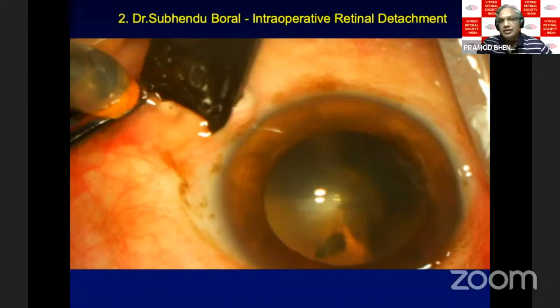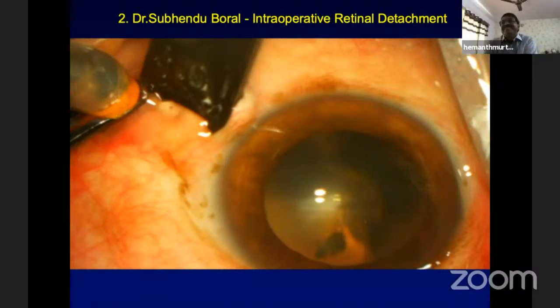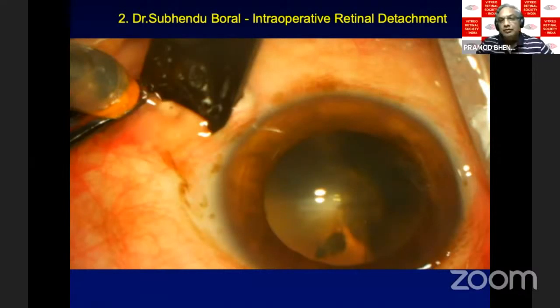Yeah, I agree with Manish. What I would have done, first thing is transfer this infusion cannula to another sclerotomy. Close this sclerotomy first, okay? And so it will prevent that bullous nature. And then you can handle subsequently very well, recheck the infusion entry, everything. And once the cannula tip is properly inside, you can reconnect back to the same sclerotomy.